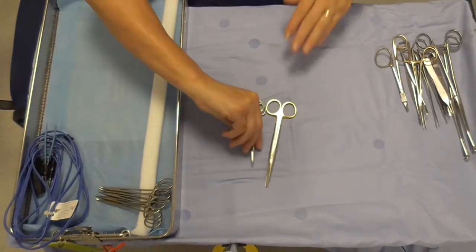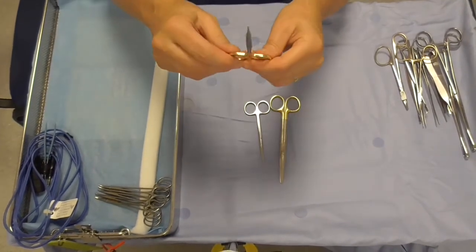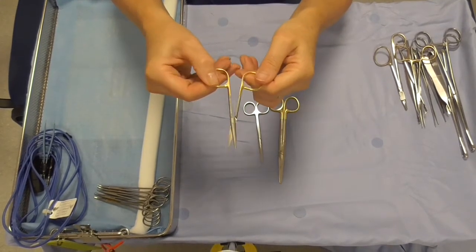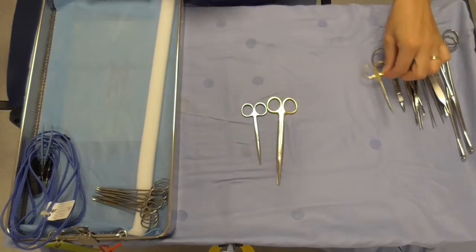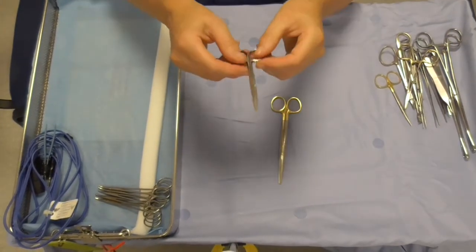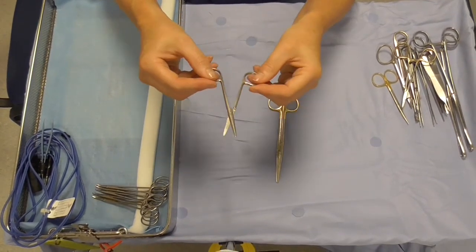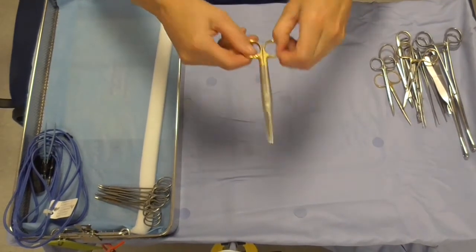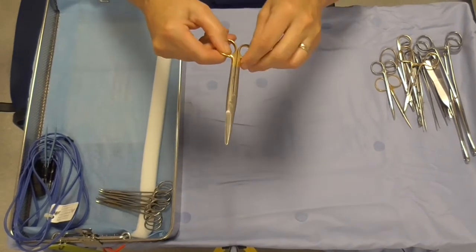We have three pairs of scissors here. We have an easy cut fine scissor for the delicate work that the plastic surgeons need to use. Then we have a small straight scissors which can be used for the cutting of sutures. And then we have a dressing scissors — obviously a much larger pair of scissors.